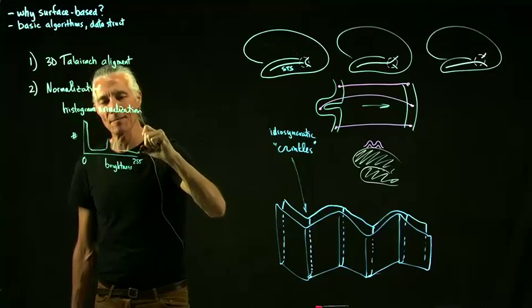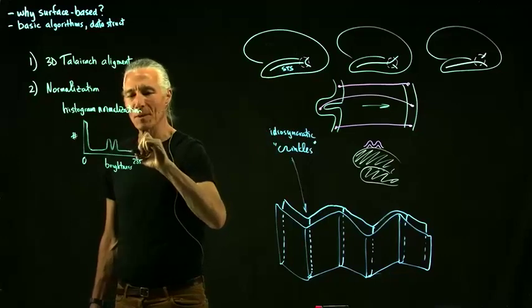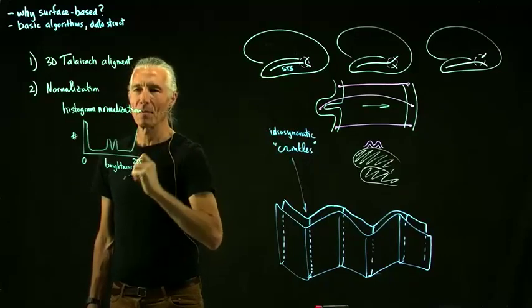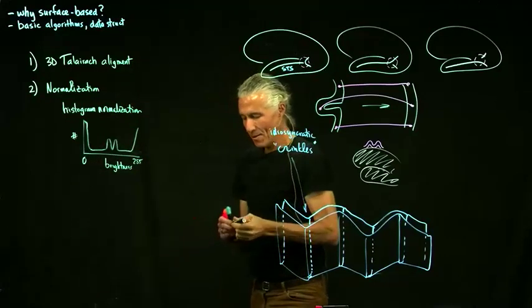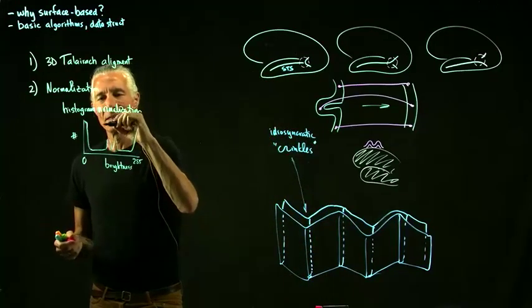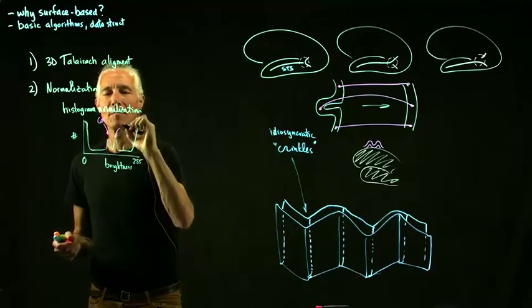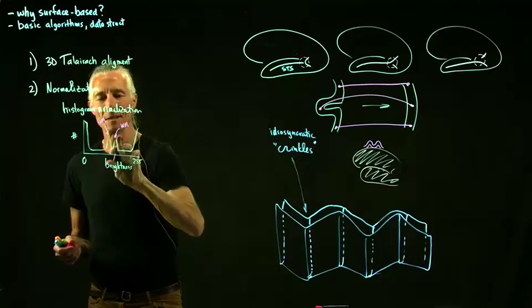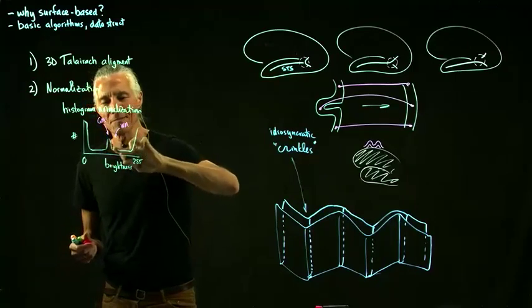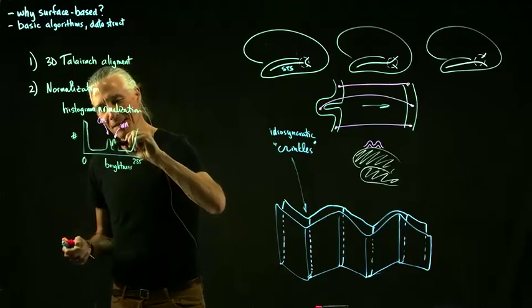Now it never looks that nice. And then you've got some blood vessels up here, real bright blood vessels. On a good day, you should be able to see that this one should be gray matter, and this one should be white matter. They won't be that close to each other, and they won't be that far apart. They'll look more like something like that.